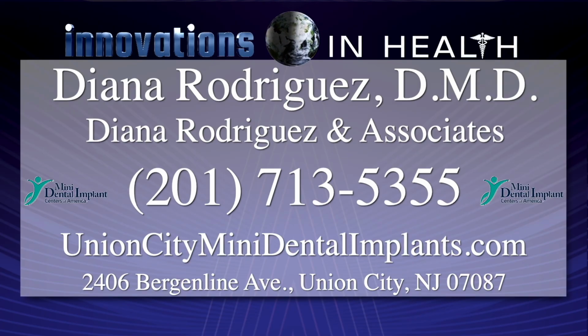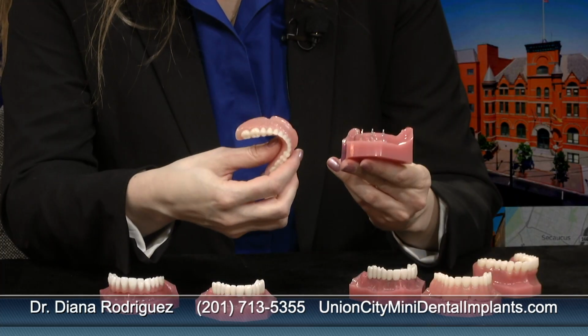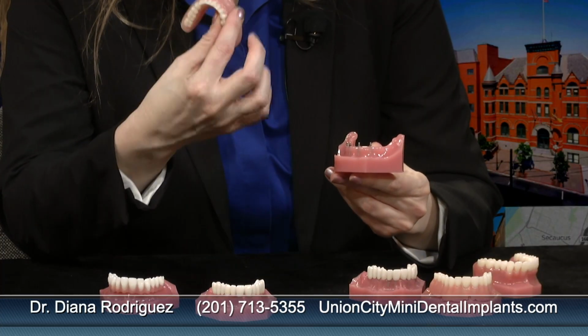Now that we've learned all about this, I'm going to go back to the models one more time, so that the viewer out there can really take a look. If they have a conventional denture, how would that change their life? Most of the time it's the lower denture that the patient is struggling with the most, but we can stabilize both. Sometimes we can use the patient's own denture. In that case, we can do this procedure in just 1 hour.